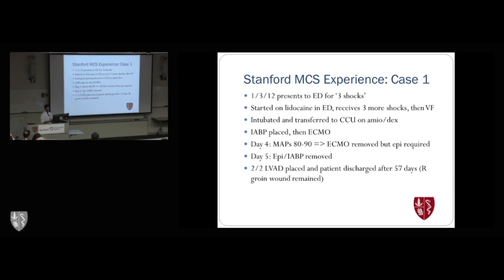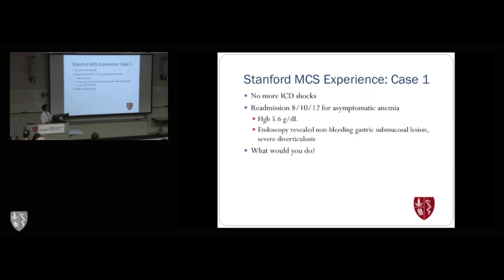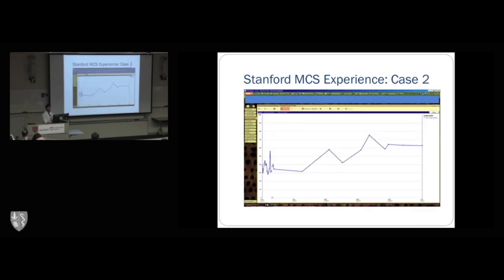He got the LVAD, did well, but then he bled. In August of 2012, he had a hemoglobin of 6, which is about less than half of what it should be. What do we do in those situations? And this was a man who was not very compliant. He would not get his INR drawn for his Coumadin, and we couldn't ever be sure that he was taking his medications. This is a marker of thrombosis, LDH, lactate dehydrogenase.